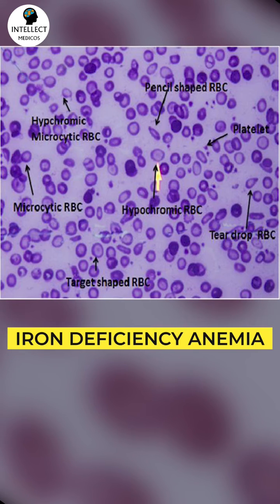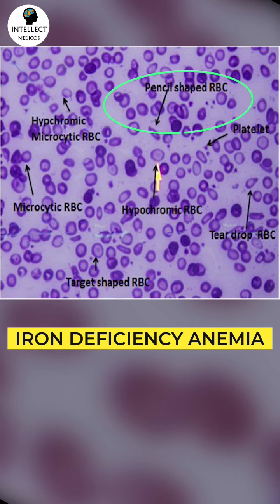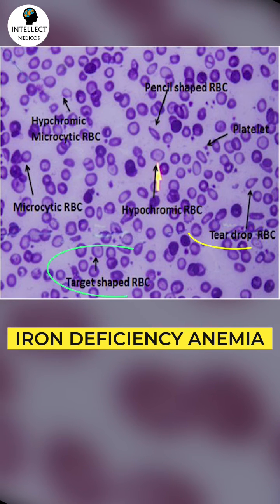The fourth slide is a very important slide of iron deficiency anemia, showing microcytosis and hypochromia. You can also see pencil cells, tear drop cells, and target cells.